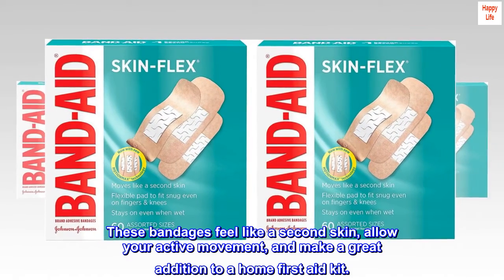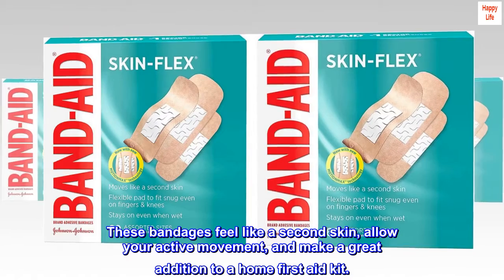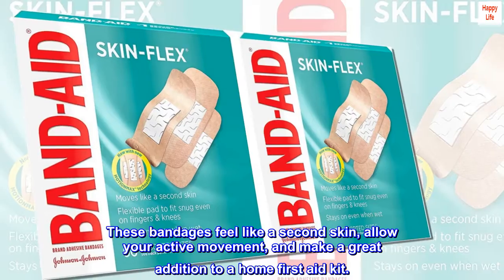These bandages feel like a second skin, allow your active movement, and make a great addition to a home first aid kit.